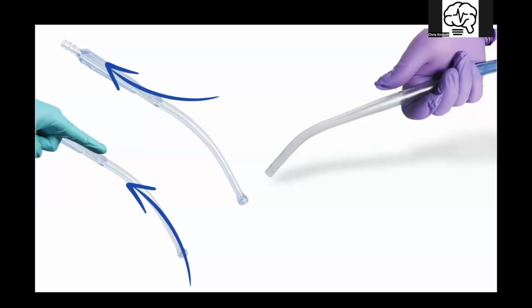Now, remember, on our suction tips, there is a port. That port that sits right here. That thumb port is a control port so that when you introduce whatever tip you use into the airway, you're not creating suction until you get it to the point where you want. So you don't get it sucking on the side of the mouth or the tongue.